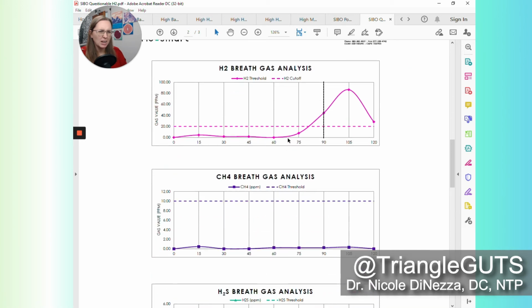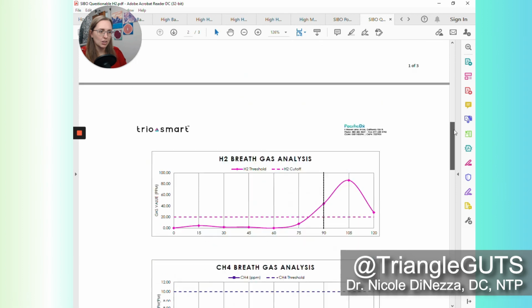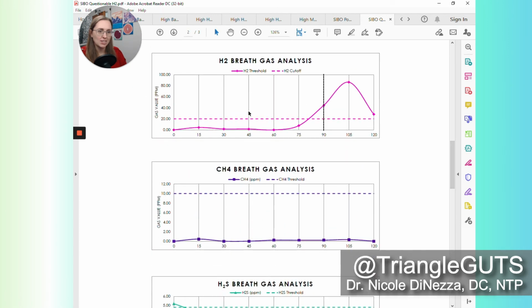And yeah, I would say that this is questionable hydrogen SIBO. And the reason I say that is, again, because this is a lactulose-based test. And with lactulose, there is some research that suggests that our cutoff for lactulose-based testing might need to be the 60-minute mark as opposed to the 90-minute mark. So for this, clearly if we're using the 90-minute mark, clearly this meets diagnostic criteria. You can see that they're crossing that threshold of 20 parts per million somewhere between 75 and 90 minutes.